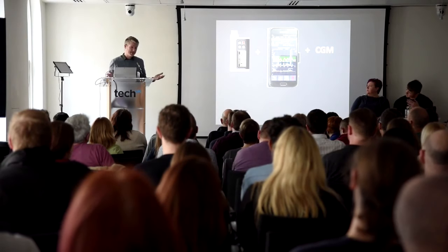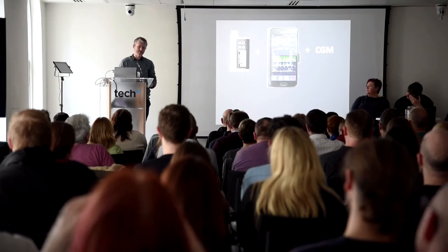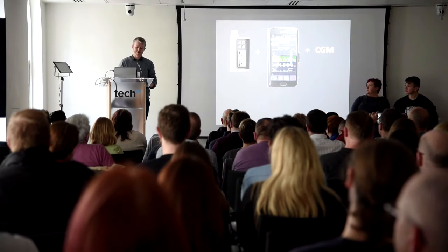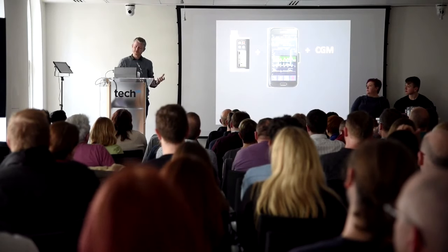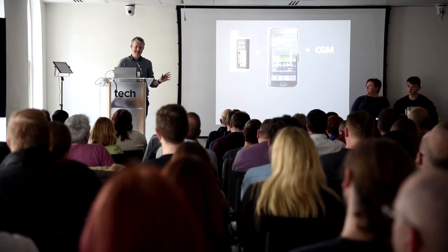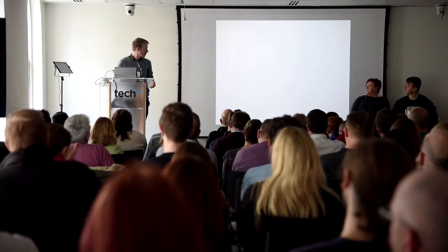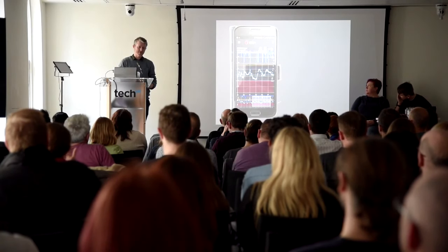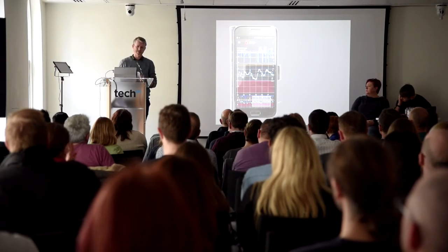Yeah, so you use CGM, some kind of CGM. I used the G5 until December and have just recently switched to the G6. You need some software on the phone to join all those things together. Like I think a lot of people, I use this program called xDrip+ on my phone that replaces the Dexcom app and does a great deal more.